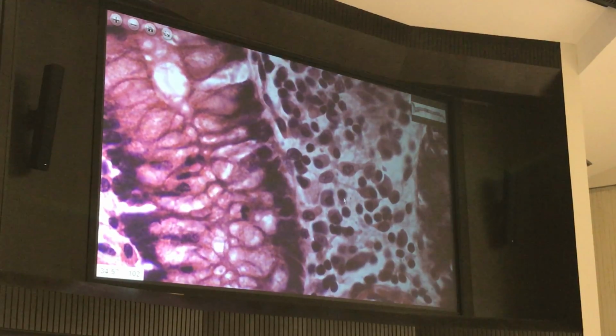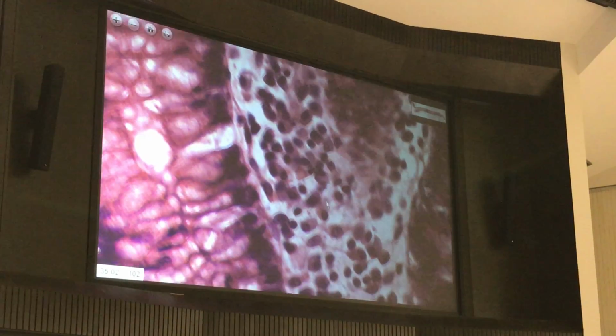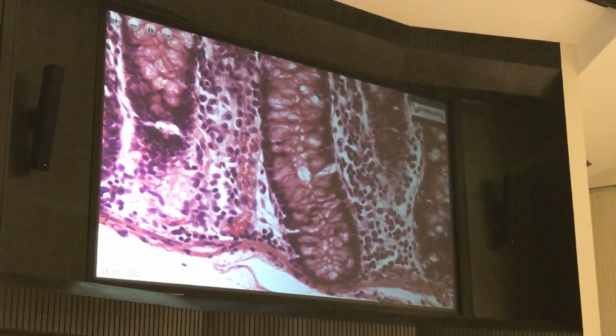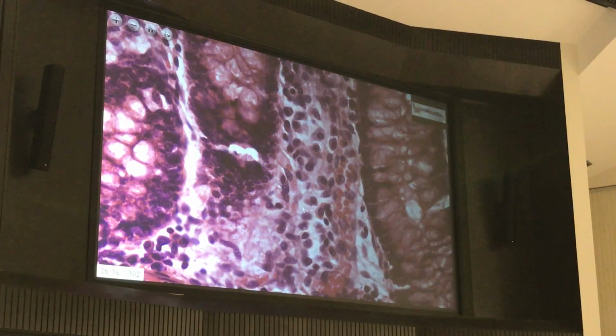What you'll see here is an assortment of immune cells, some large macrophages, fibroblasts. A lot of these are lymphocytes hanging around. And this is again the colon. Why might you have more immune cells in the wall of the large intestine versus the small intestine? And you see more as you go down. Why would you think that might be true? It's getting more waste-like. Yes, because more waste.